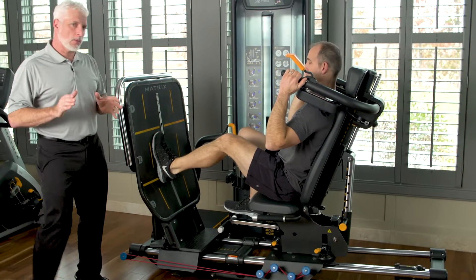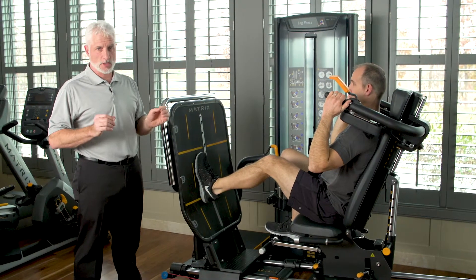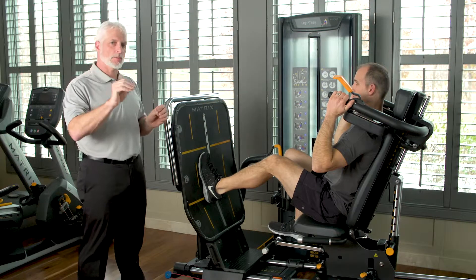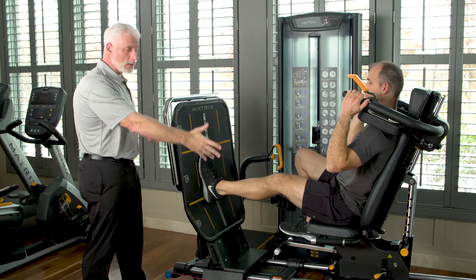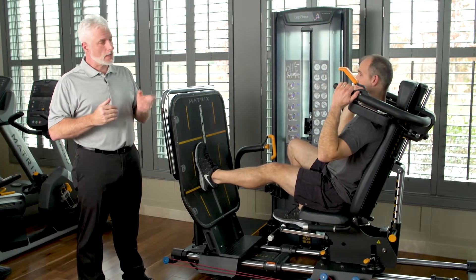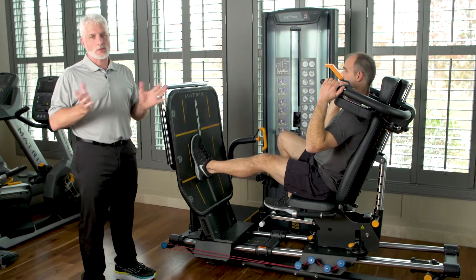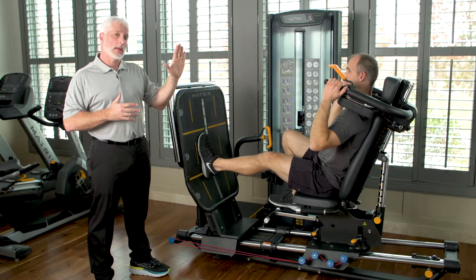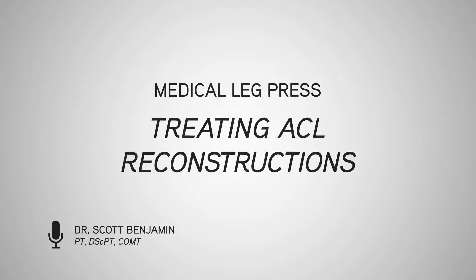One thing to point out right away: if you notice, he did not flex all the way, and the reason he didn't do that is because he's protecting the graft. He's still getting quad power and glute power because he's exploding through the rebounding activity. He's also using extra band resistance at the bottom to gain more quad resistance through the range, but he's not flexing all the way to protect the knee and the graft. All ACL reconstructions can do this on this machine. You can also lay down the seat to get a different position so the muscle is worked differently as well.